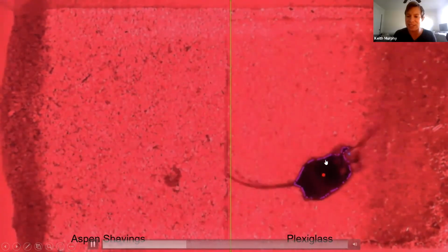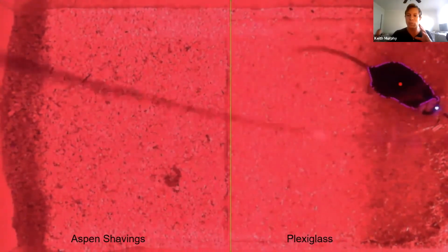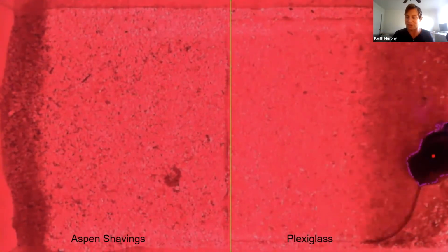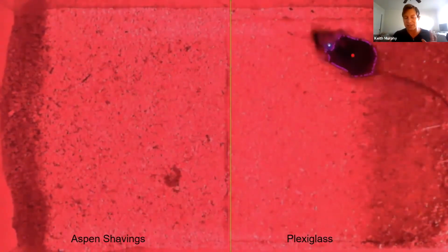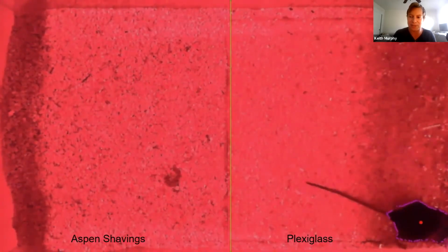If we stimulate them only on one side, we can start to say, do the animals like the ultrasound, by asking whether or not the bias for the plastic or the bedding shifts when you deliver ultrasound. So fun experiments like that are things that Kim and I are super keen on with the mouse.